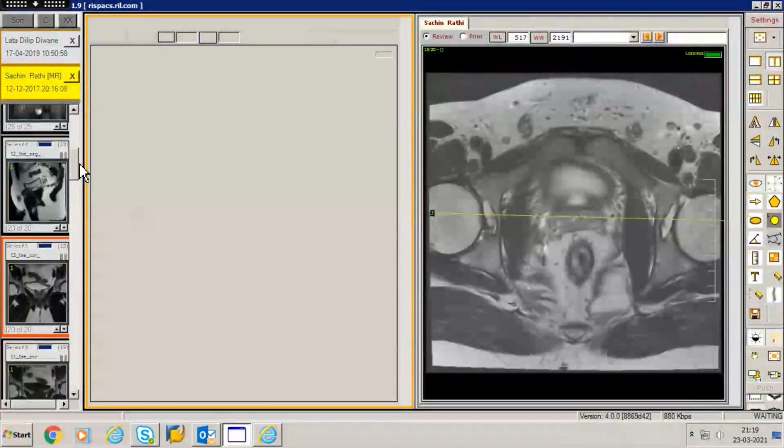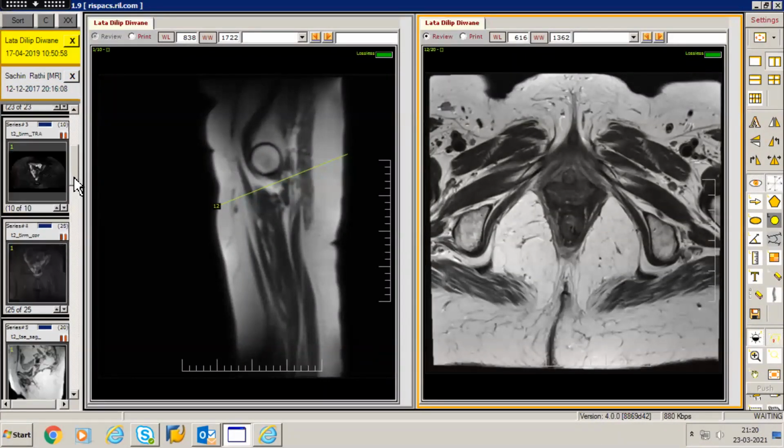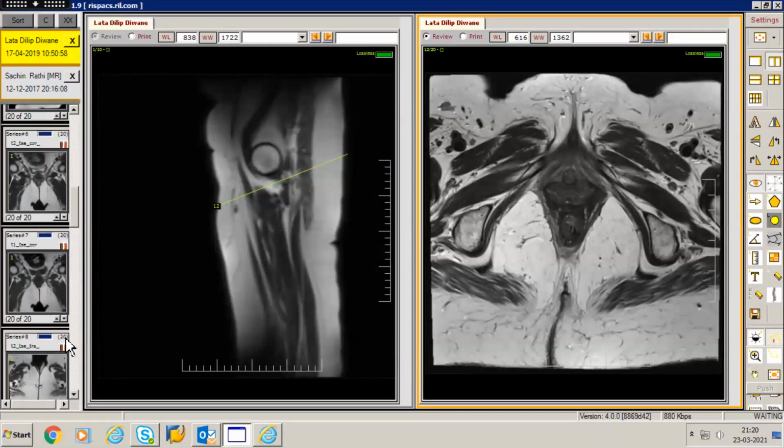Just to again familiarize ourselves with the female anatomy. Swaroop. Yes, sir. Yeah. Read the puborectalis on the sagittal also and with the levator shelf. That's very important. Yeah, I am coming to that.